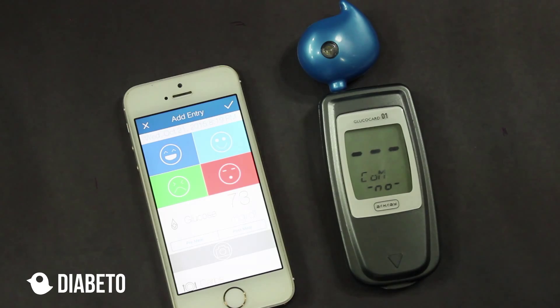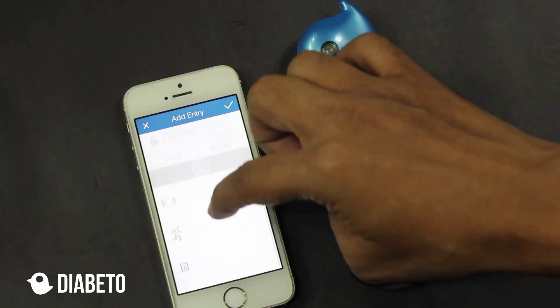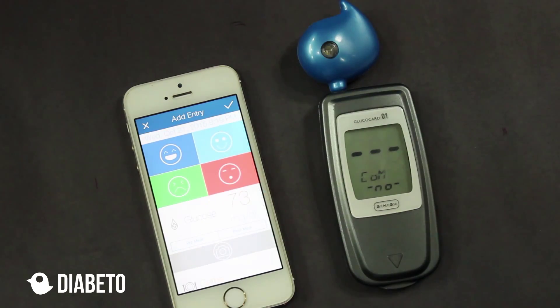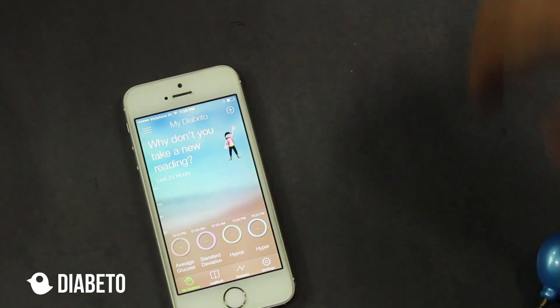The last reading is 73. I can select other parameters such as mood, I can select whether it's pre-meal or post-meal, the carbs, the activity if I did any, and any notes. I'm not going to save the reading right now because I want to sync the other glucometers only for demonstration purposes. So I'll quickly not save the reading and remove the Diabeto from the glucometer.